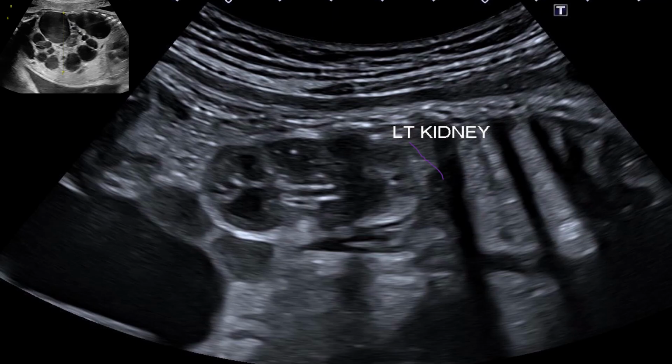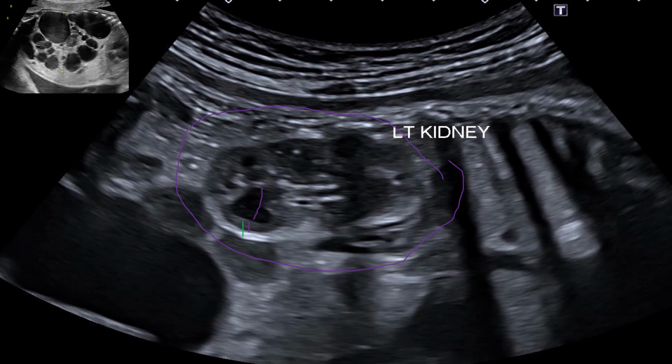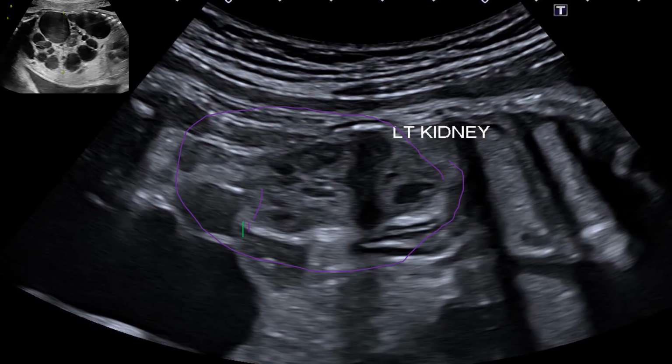You can see that's a normal kidney, and you can see how you can actually differentiate the cortex and the medulla. So this kidney is well differentiated. The collecting system looks fine, the medulla is fine, the cortex is fine. As you can see, there is a well differentiated kidney, well differentiated kidney.